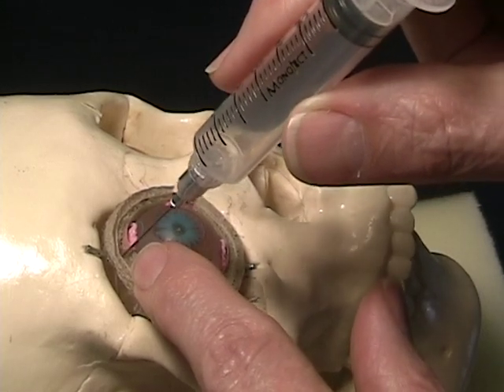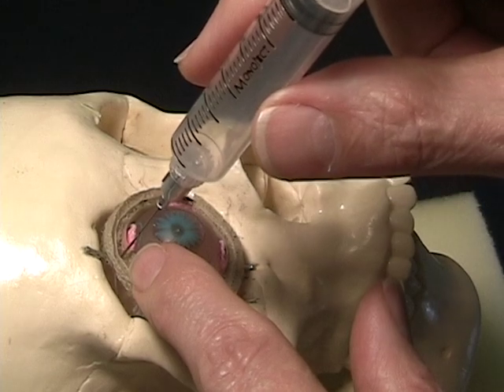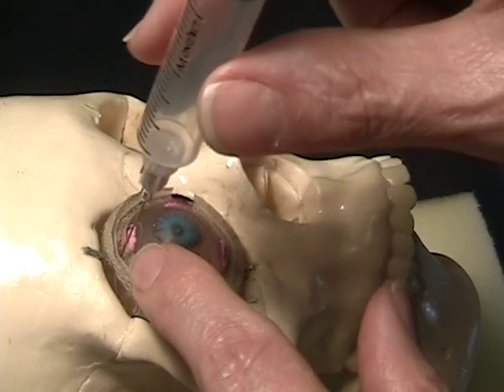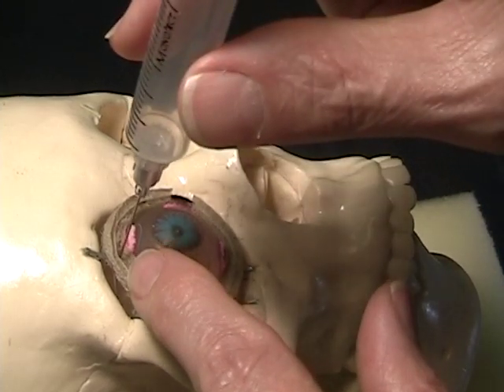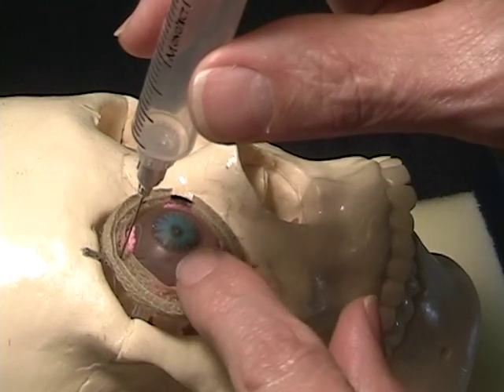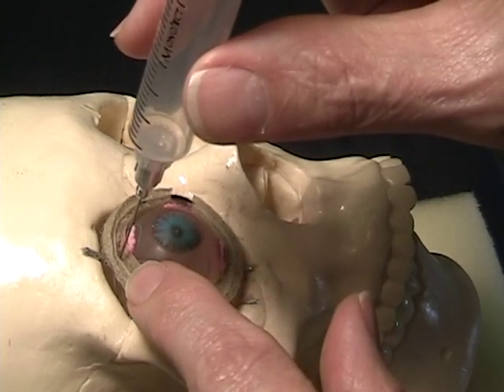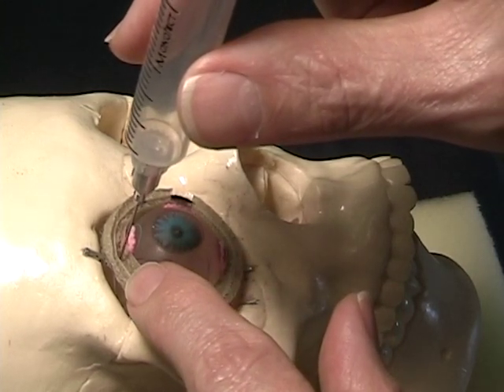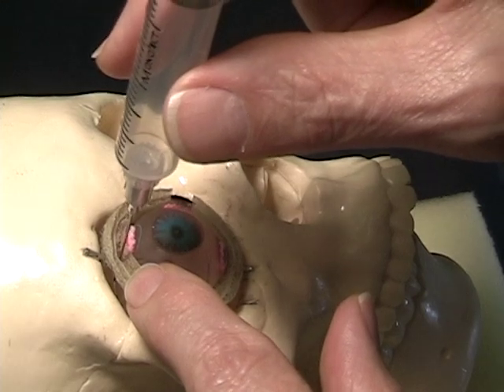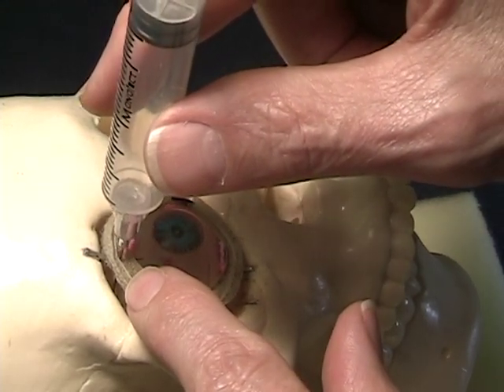Once we've gone through the skin and the orbital septum, we will then move the syringe to a 90-degree position, rotate up the upper eyelid so we can observe the globe, and at that point start a slow insertion straight back to a full depth of 1 inch.